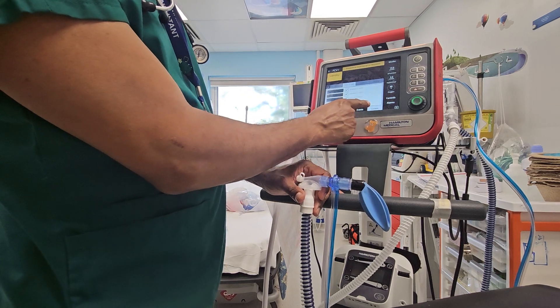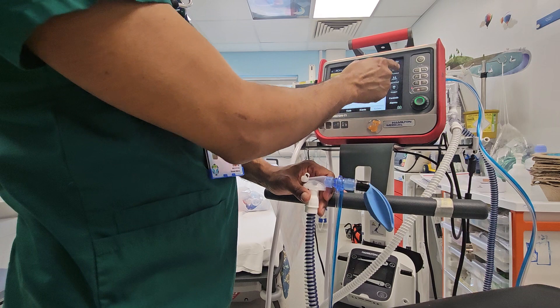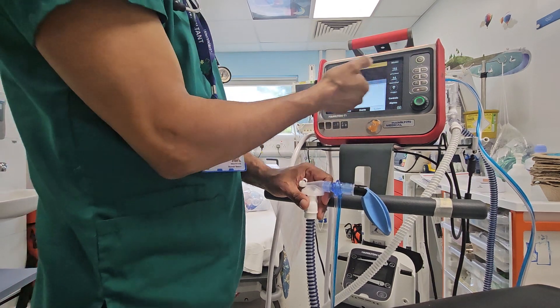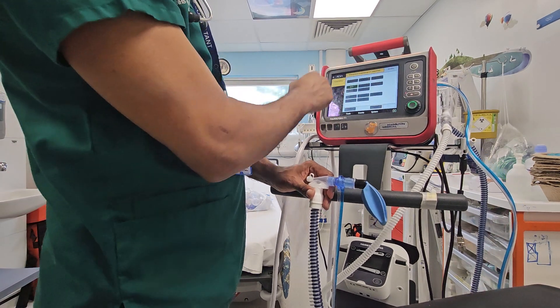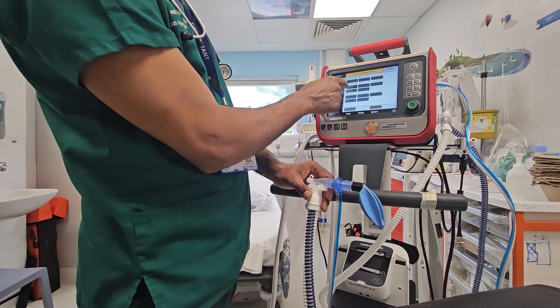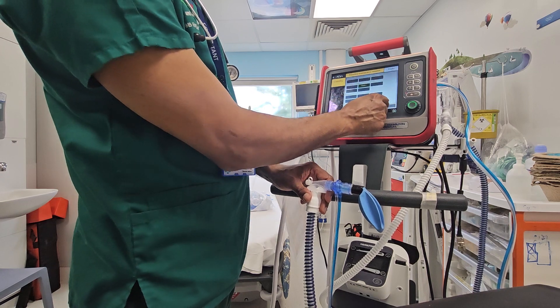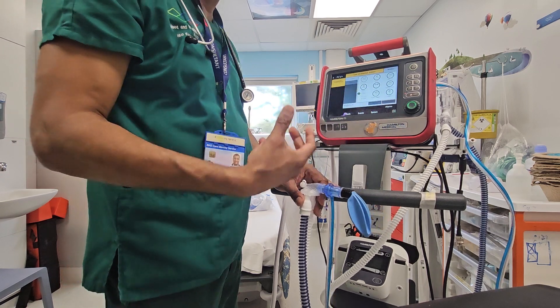Click on that — started. Click on modes, and it gives you several modes of ventilation. The most commonly used one is pressure control, which is PC-SIMV. Confirm it — everything has to be confirmed for it to become active.